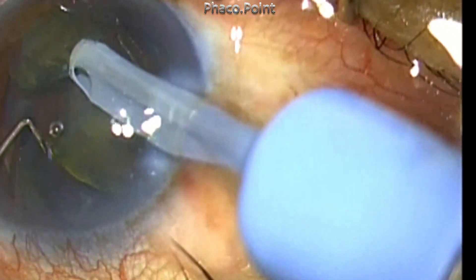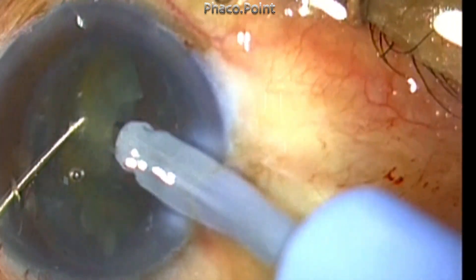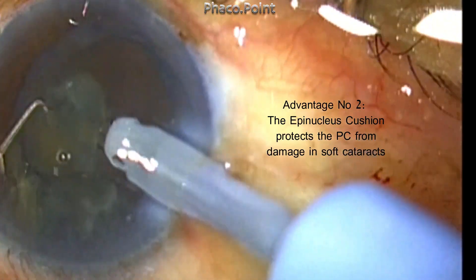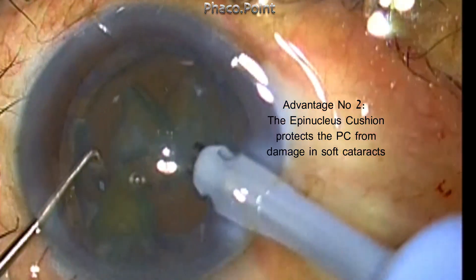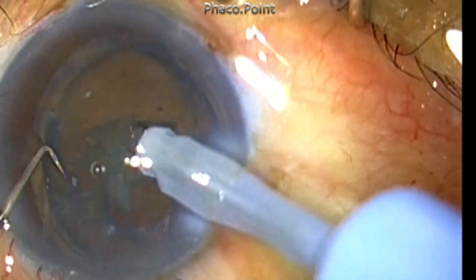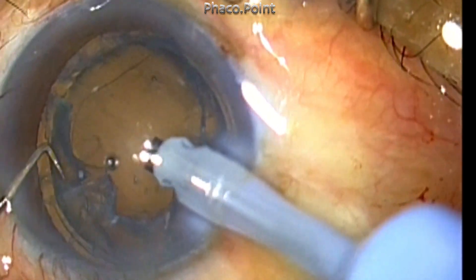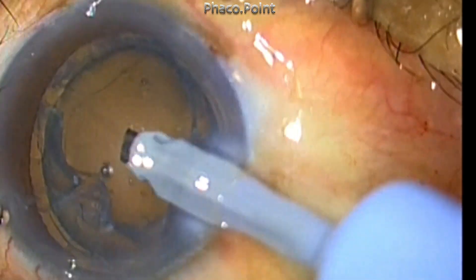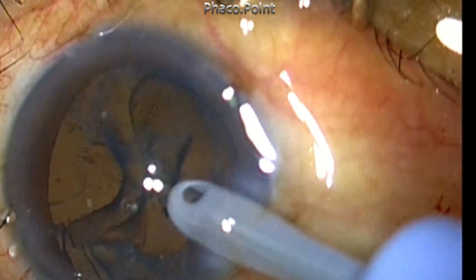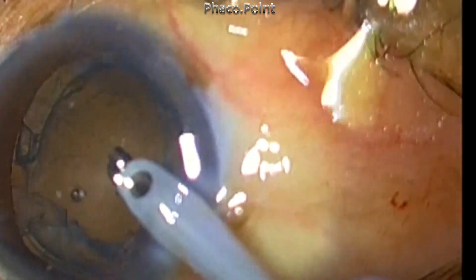The second major advantage is that during phaco emulsification in softer cataracts, it is possible to have cheese wiring, and therefore the thick epinucleus shell will create a protective barrier and protect the posterior capsule from damage. You can see that the thick epinucleus shell that is left behind is quite difficult to remove.